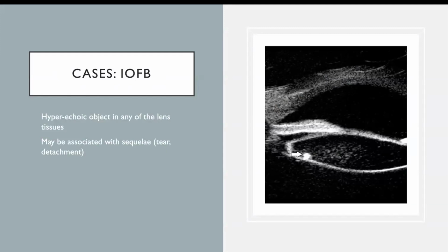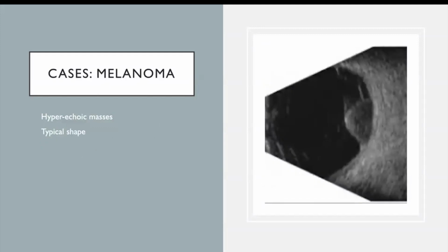And then you also may find things that are associated with intraocular foreign bodies. So they may have a vitreous hemorrhage that you might see on a B scan. They may even have a retinal detachment, or potentially a globe rupture with corrugated lines at the sclera. All of this points you towards wondering what has happened to the patient and whether or not they're having any problems.